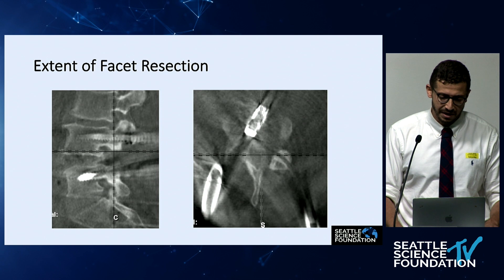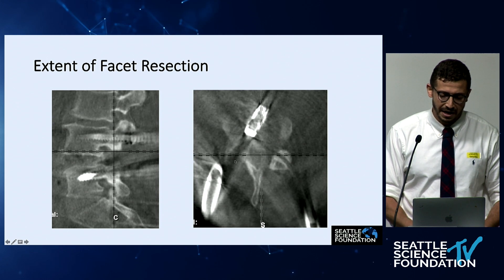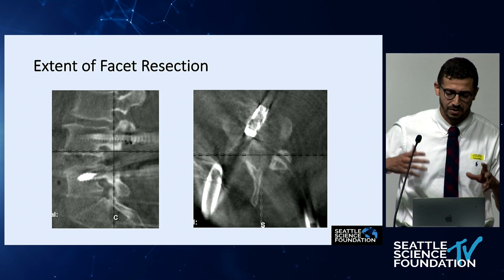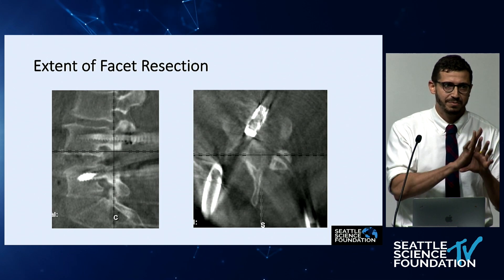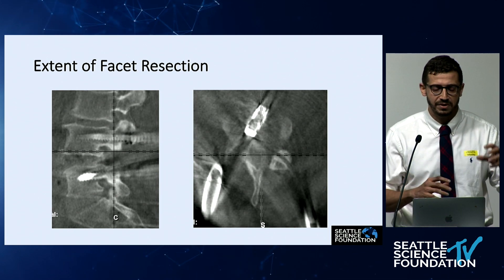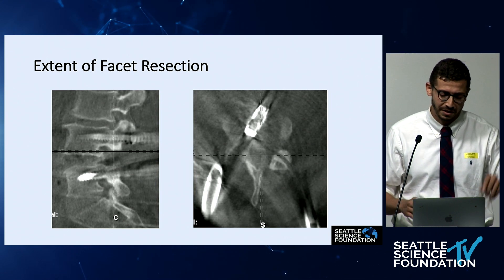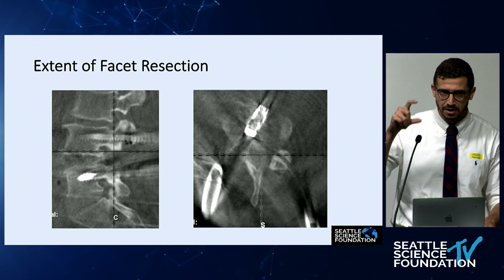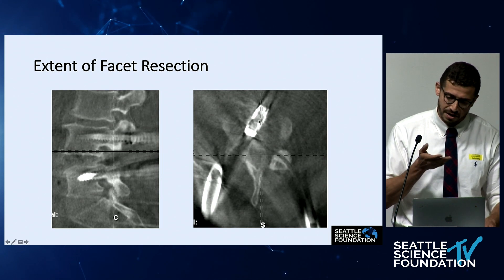This is an intraoperative CT scan showing the extent of the facet resection. We did a right-sided T-lift here, so you can see the facet is completely gone. This is all done from a very lateral approach using the reamers shown earlier. He docks the endoscope into the SAP and uses reamers to take out the whole facet, finishing the facetectomy with a drill. Then he goes from a more medial approach — through the pedicle screw incisions — to put in the cage in a more central, conventional location.